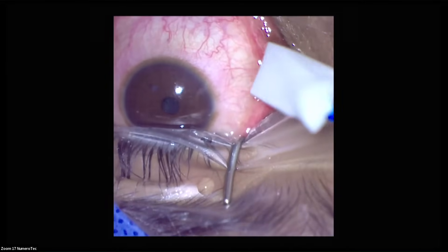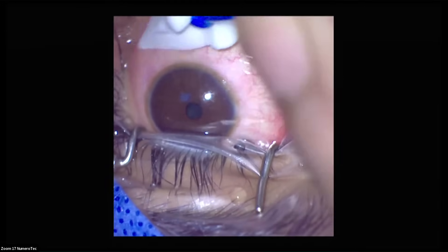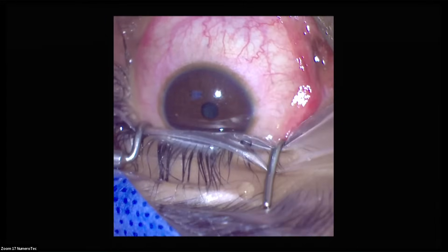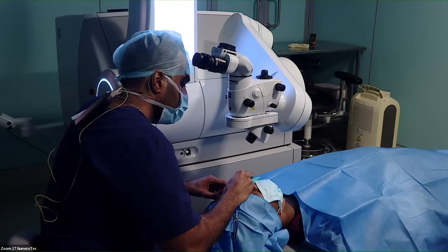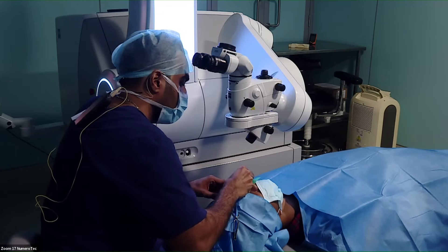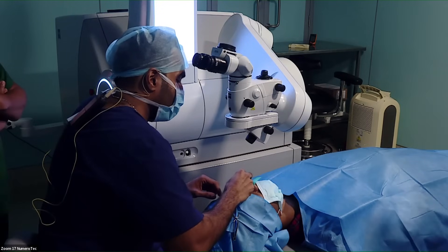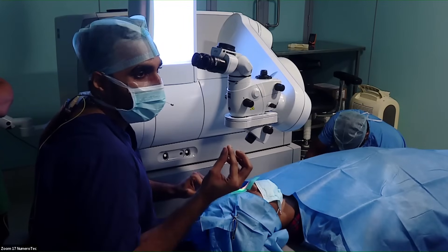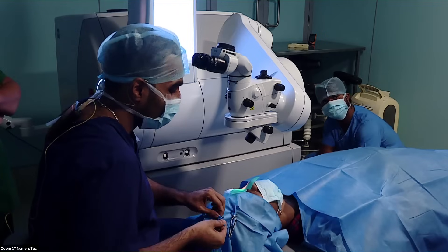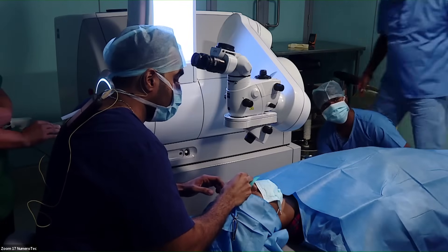So I'm going to show you the drying now. This is a very critical step of the procedure. We have to keep the conjunctiva absolutely dry. If the conjunctiva is wet, you run the risk of suction loss during the procedure. I'm taking my time to make the ocular surface as absolutely dry as possible. A lot of what you do in SMILE is proprioceptive — you have to feel the feedback on your fingers, which is much easier without gloves. The surface is dry but the cornea is kept evenly wet.